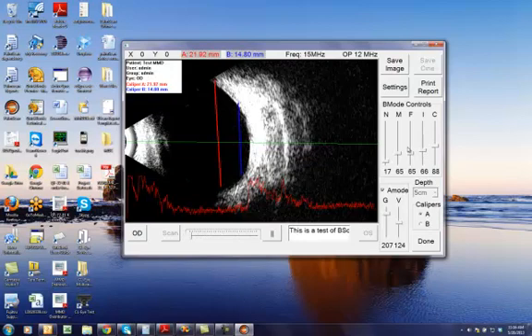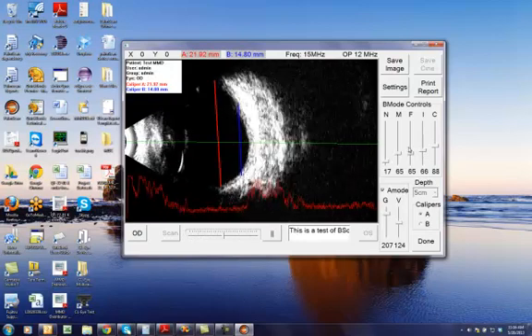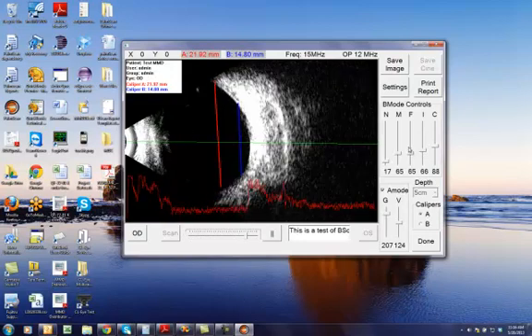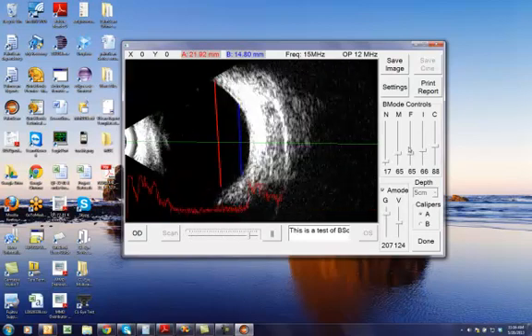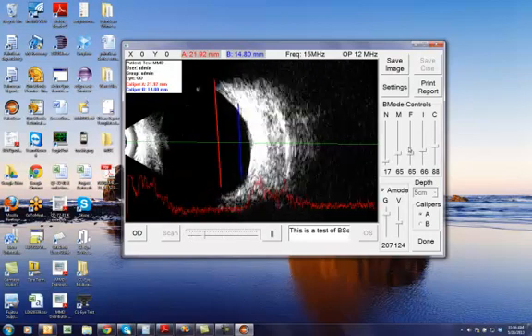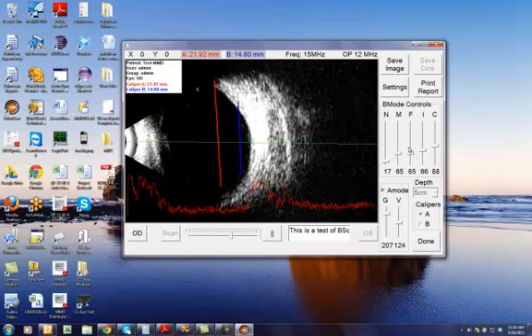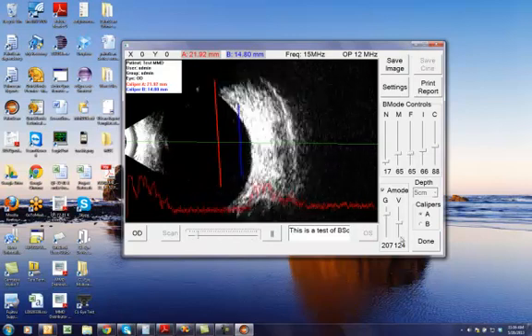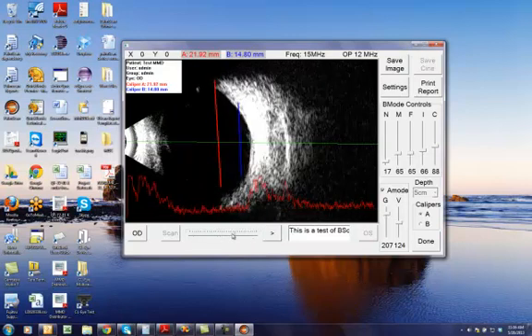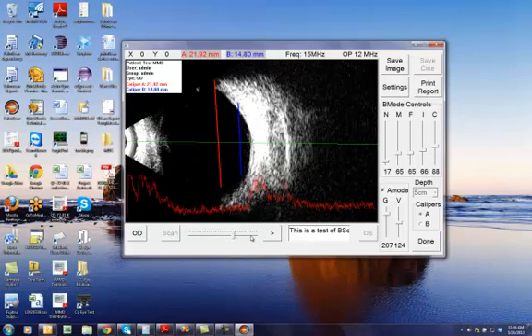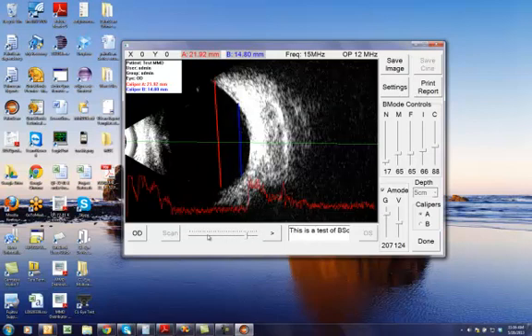And as you can see, the device or the software automatically plays back the captured image. Again, you can pause it at any time, move the slider over to any of the frames.